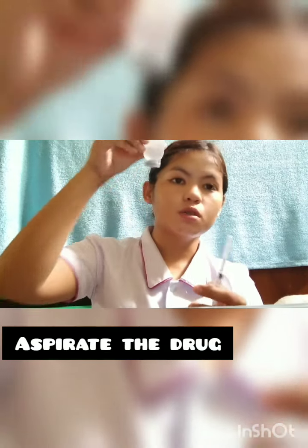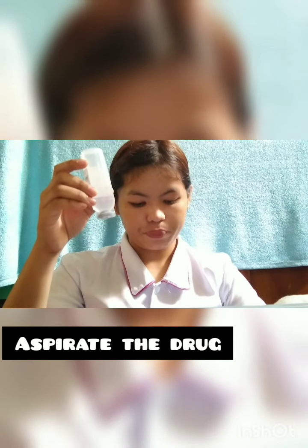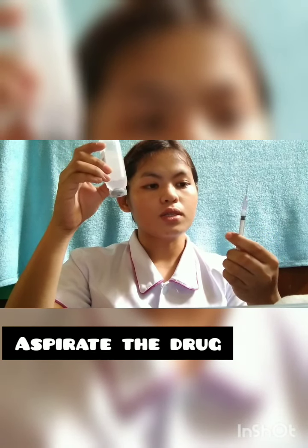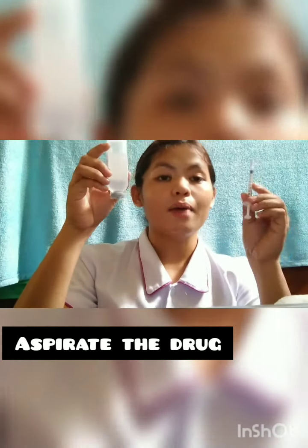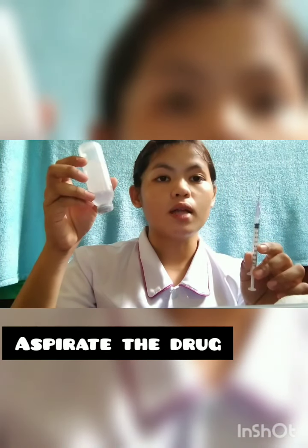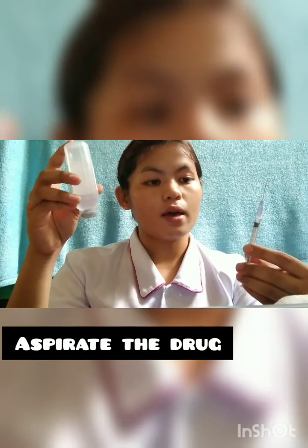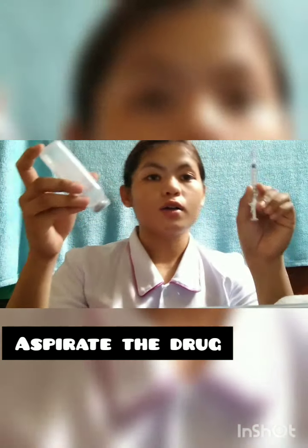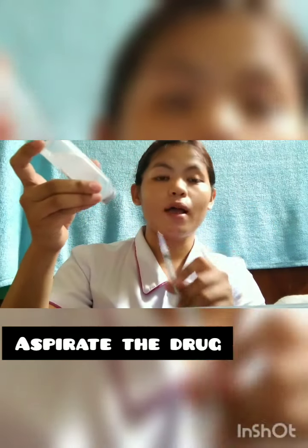We have to move it like this, upside down, and then I'm going to put in air. The air must be equal to the liquid that we are going to withdraw here. So I am using this syringe and I will insert 0.1 ml of air because I am going to withdraw 0.1 ml of the drug.